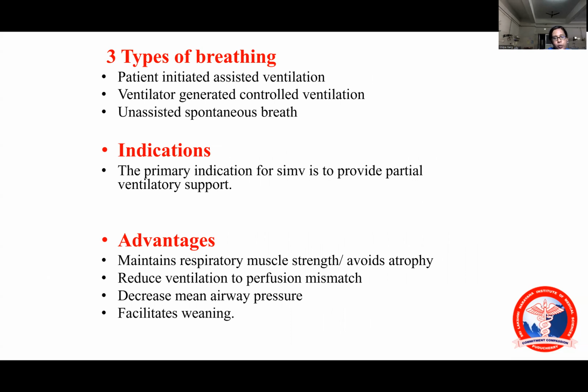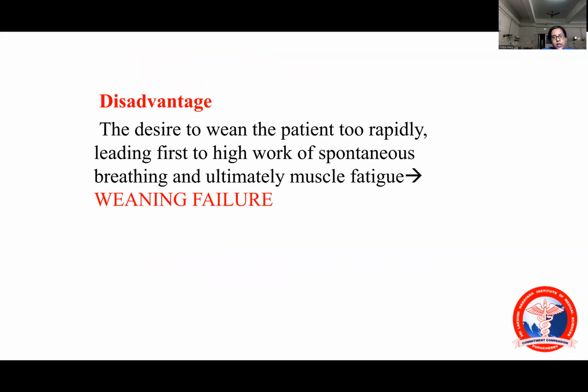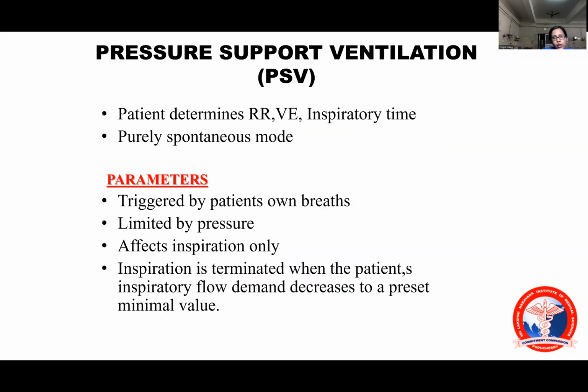What is the indication? To provide partial ventilator support. The advantages are it avoids disuse atrophy, reduces ventilation perfusion mismatch, decreases mean airway pressure, and facilitates weaning. Disadvantages: sometimes it may lead to weaning failure also.